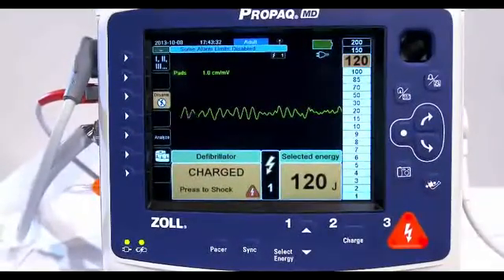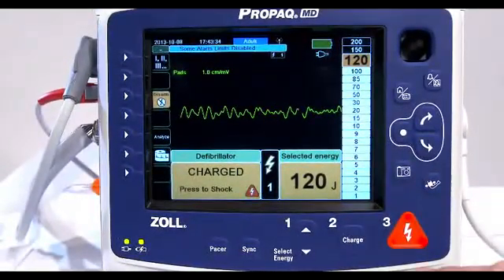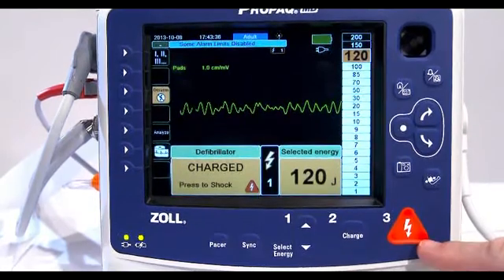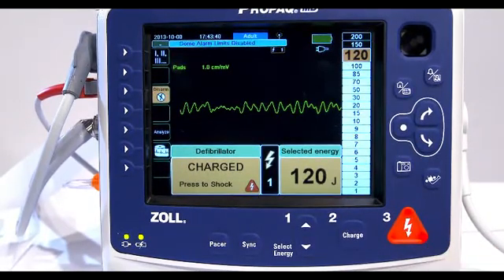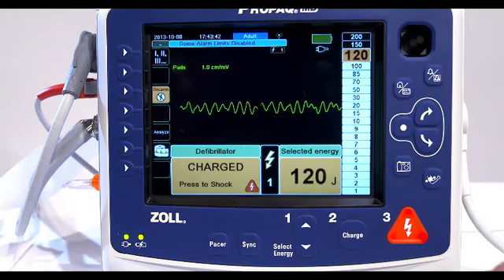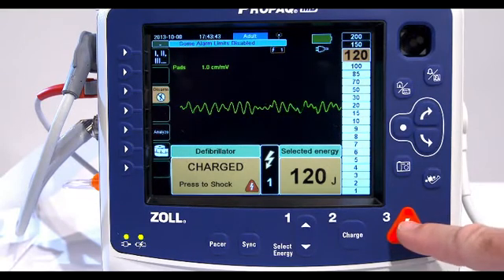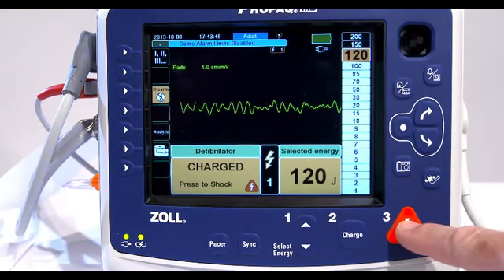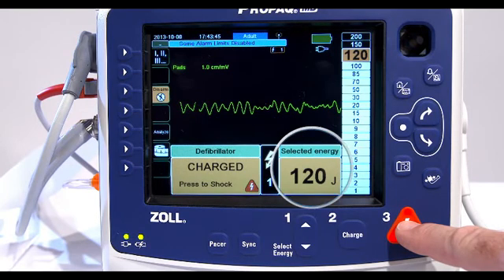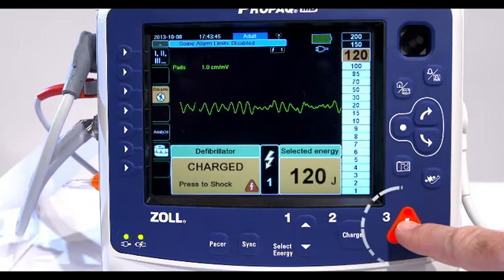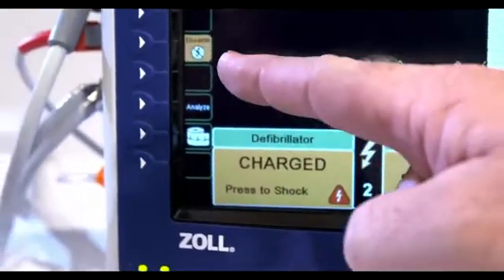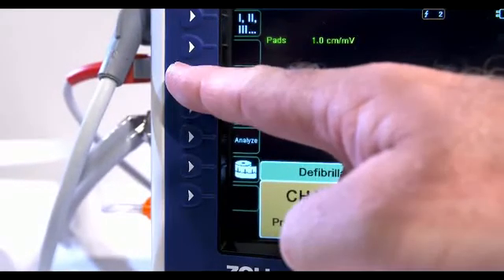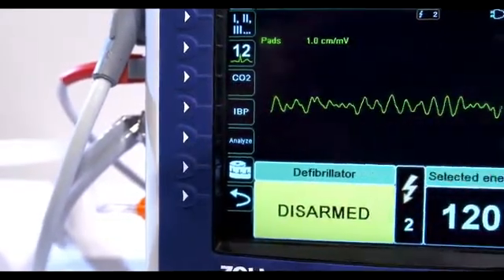The energy range bar graph on the right side of the display highlights the charge level until it reaches the selected energy. When the unit is fully charged, the tone changes to a continuous charge ready tone. The highlighted energy bar graph includes the selected energy and the shock button lights up. If at any time you want to cancel the defibrillation, press the disarm quick access key.